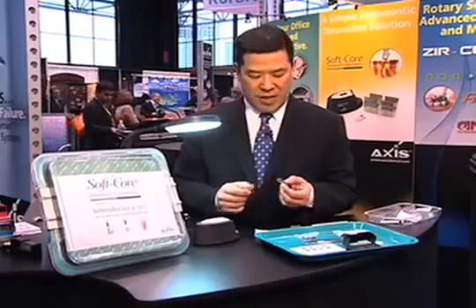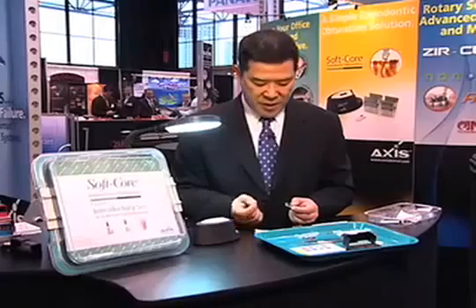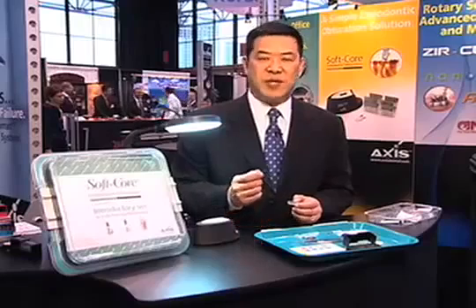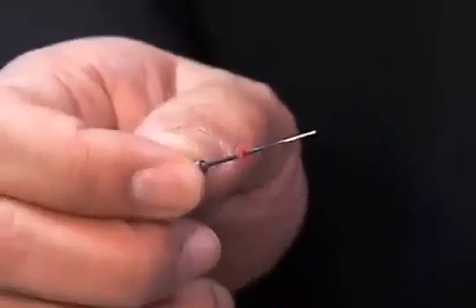Here we have a plastic insert that looks like a canal that we have cleaned and shaped, and let's say you're ready to obturate. What I typically do is leave a paper point of the correct size to the apex, and I leave it in there as I'm getting my materials ready to obturate the canal. What is included with the Soft-Core kit are these soft verifiers, and what a verifier does is it carries your cement that I have here, and it also verifies that the obturator you're going to slip in is going to be at the apex. It's going to fill things to the apex.